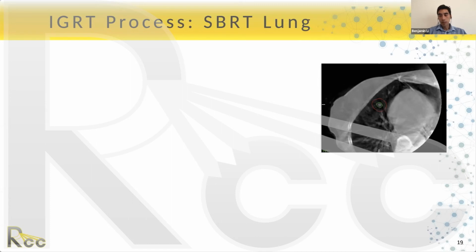There's a question from Iqbal Alamri. What is the max couch rotation we can apply for SBRT treatment? That's a good question. Typically, I would say maybe on the order of 1 degree.